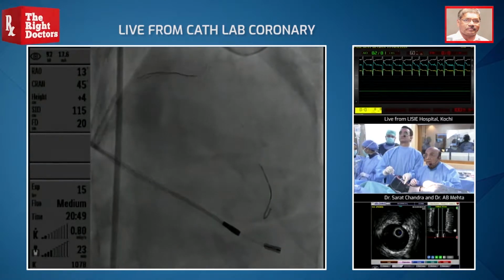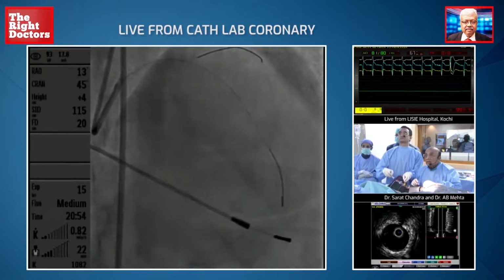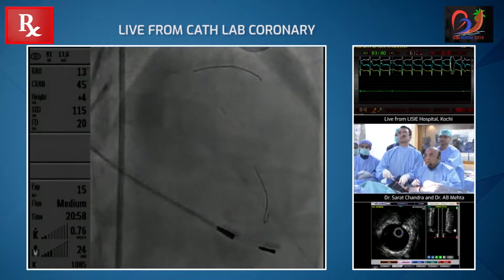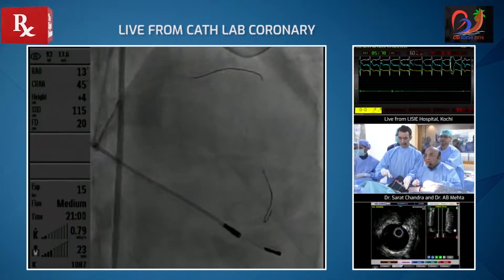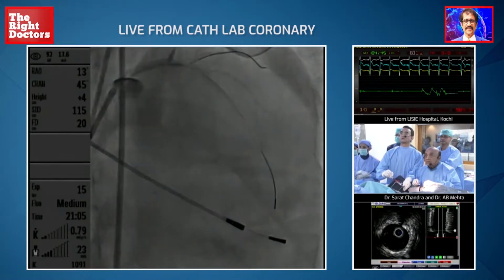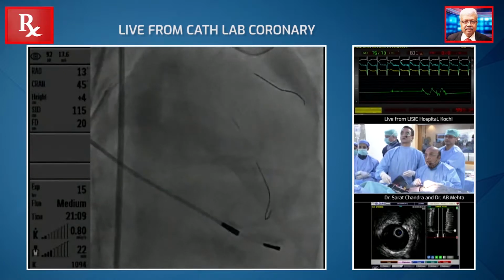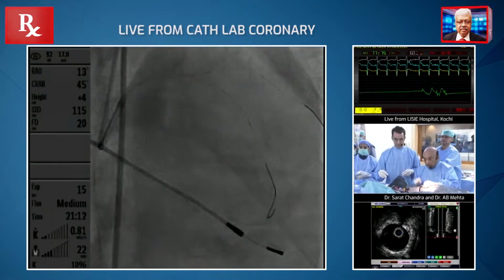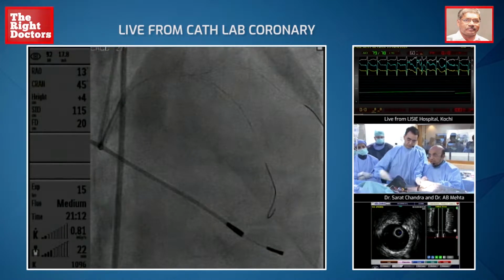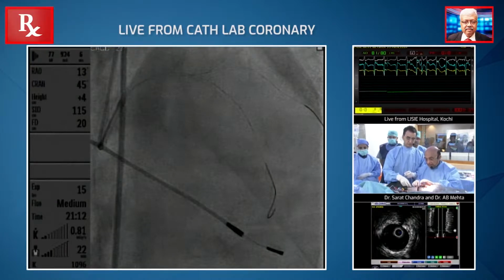But I think it is important to check the results of stents by physiology, to tell you that you've achieved what you set out to achieve, which is to eradicate ischemia. And the LAD really illustrated to us, I think, how imaging helps us to optimize that result.